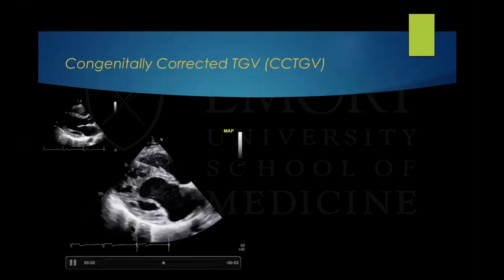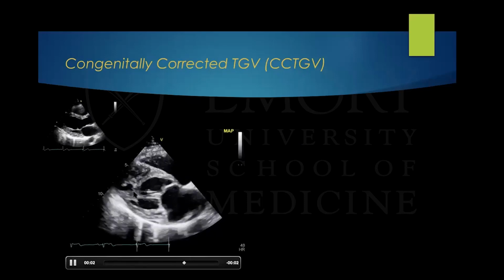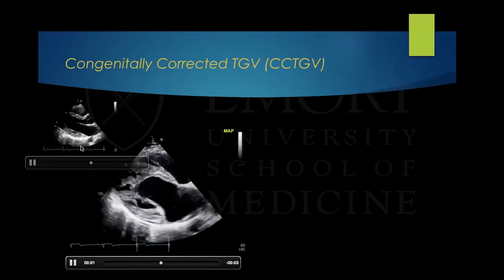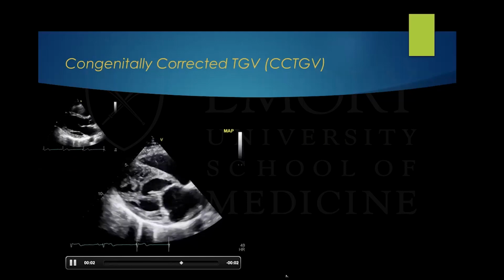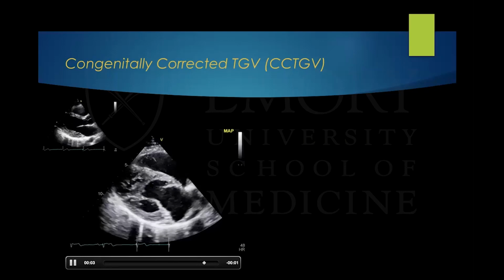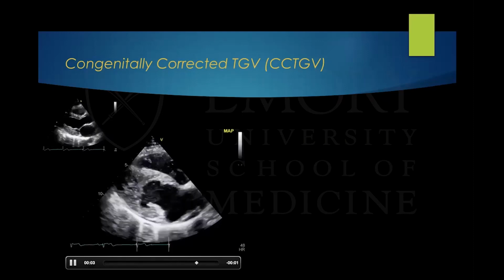On the parasternal long axis view, you're going to encounter that the posterior ventricle is very heavily trabeculated with a moderator band. On top, I put a normal parasternal long axis so you can see the difference of the two. This left atrium is connected through the tricuspid valve into a right ventricle and out to the aorta. This is the anterior ventricle, which is now the left, functioning as a pulmonic ventricle.